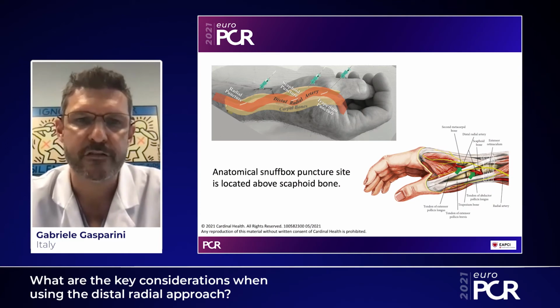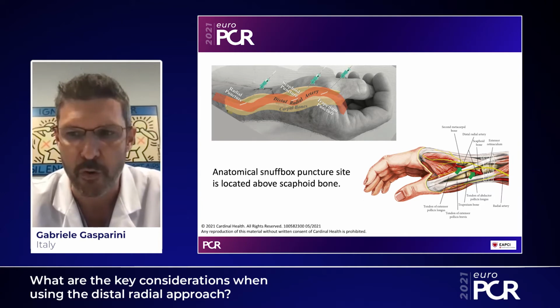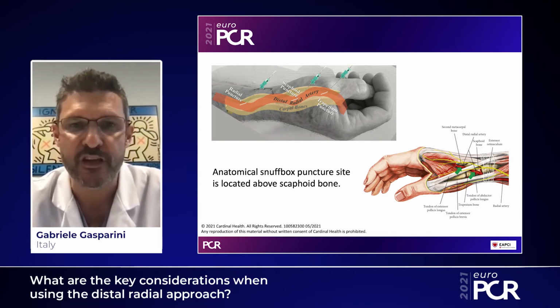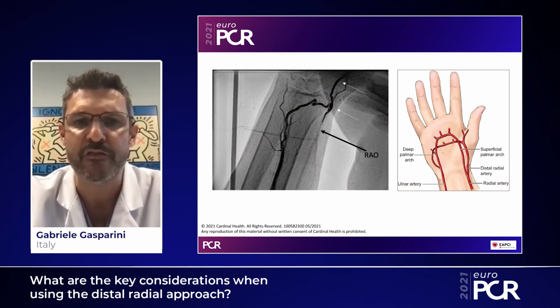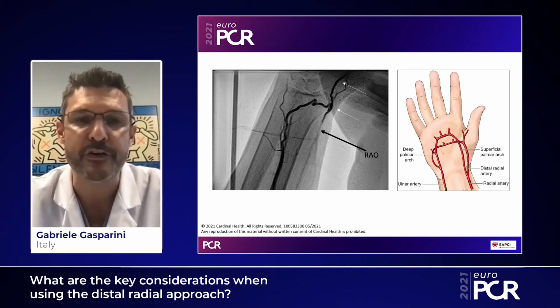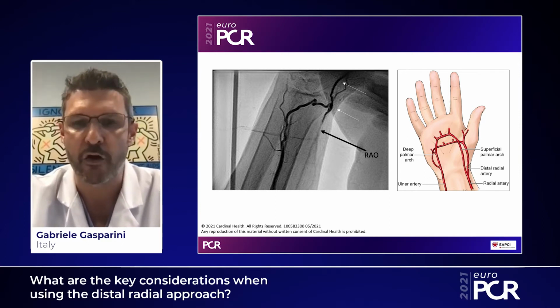The distal course of radial artery is more superficial and runs along the bone, which makes it easier to compress, suggesting its potential role for faster and easier hemostasis. Additionally, puncturing distally to the superficial palmar branch should theoretically preserve antegrade flow through the radial artery, even in case of occlusion, preventing thrombosis over a long segment.